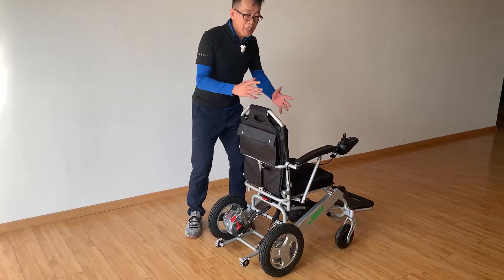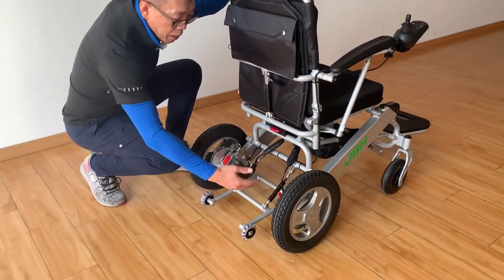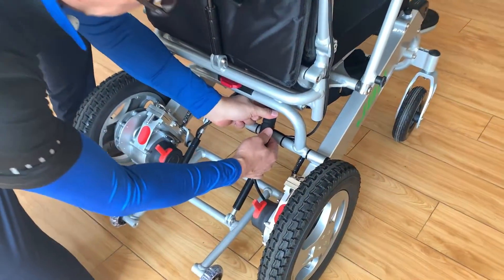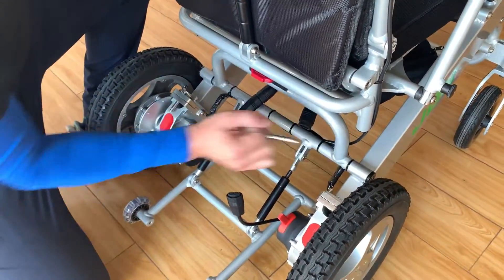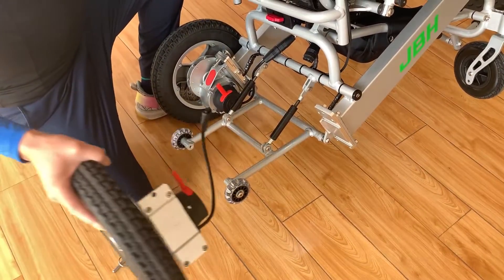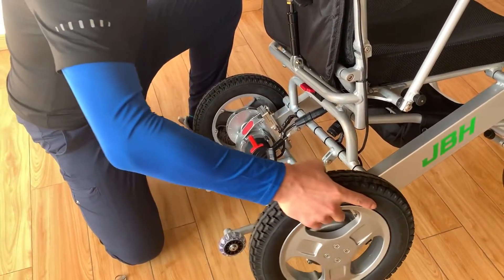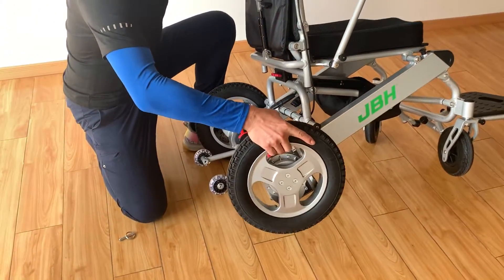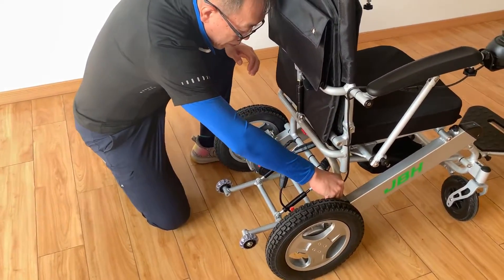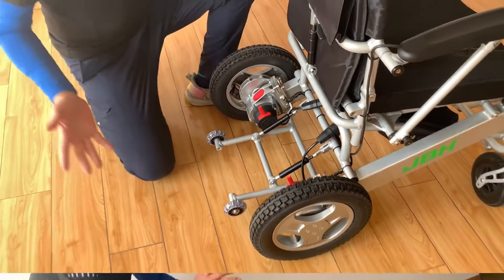Finally, the most important feature: the wheelchair is really heavy and a lot of people have difficulty folding it and lifting it. This model has an attachable motor. In only three steps you can remove the motors: first, take this out; second, pull out the pin, then tilt it a little bit and slide it out. Once you take these two motors out, the weight will be very light. Then you slide it back in, push the pin back to lock it for safety, and connect the wire. It's all set.